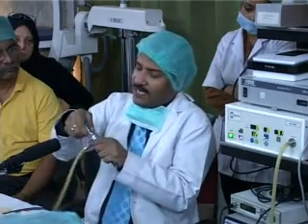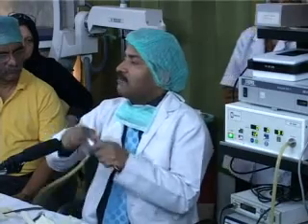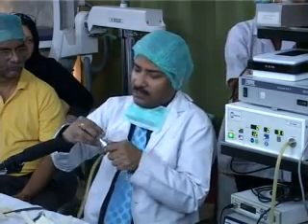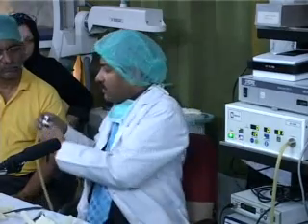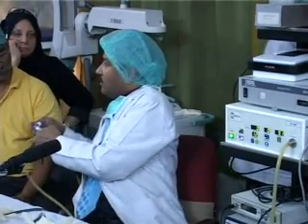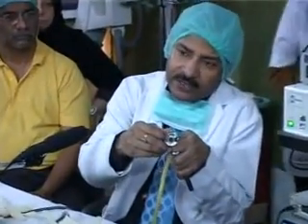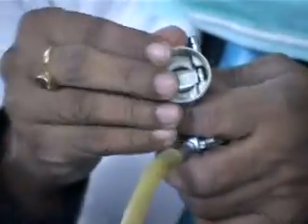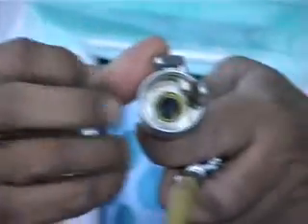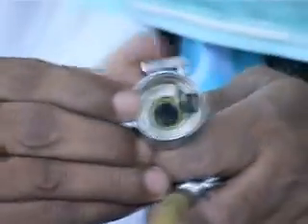Another way of leaking is at the level of your valve. Inside the valve there is a washer. If you look, there is one yellow washer inside, and this is just like the washer of a pressure cooker. It has a washer here, this yellow one, and if it gets torn, then this will leak.